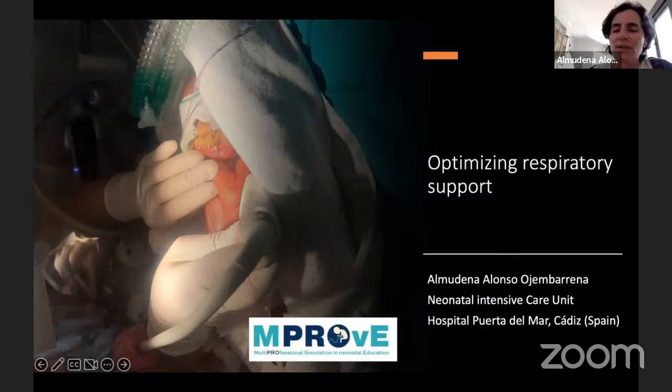No, I mean, maybe I misunderstood you. The final decision to admit an infant to the NICU is just clinical. I mean, it's a requirement of oxygen, increase of work of breathing, or whatever. But using lung ultrasound early at 1 hour of age, or even 30 minutes of life, you may divide the infants by the risk of needing admission afterwards. And if you see the low risk pattern, then you can understand that this infant, you won't need to see him again afterwards. I don't know, it does more or less.